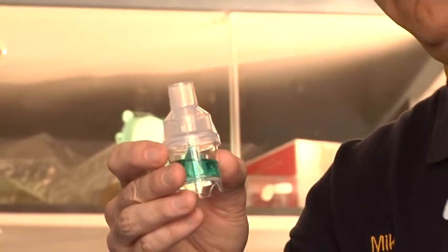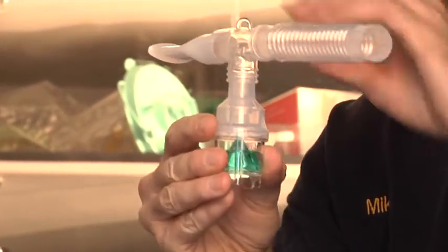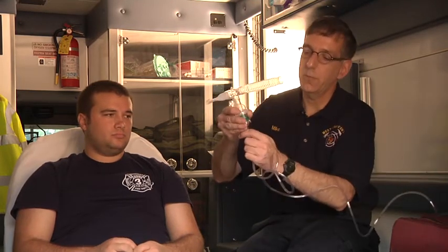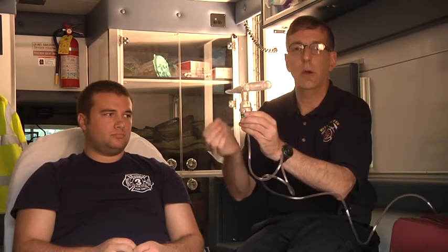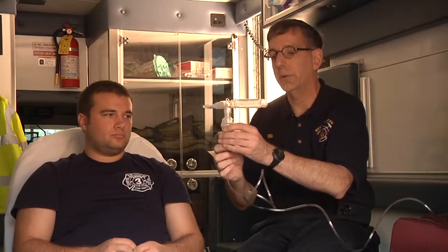You need to be somewhat cautious that this doesn't dump on its side or get shaken excessively, because it has a tendency to spill out of the nebulizer. We'll attach it to oxygen tubing, which plugs into the bottom of the nebulizer and creates a venturi effect where a large amount of oxygen flows through a very small pinhole and magnifies the flow of oxygen.